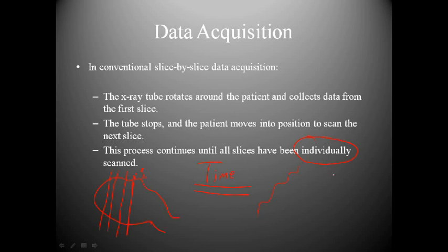And so it has a stair-step pattern, and it looks like you're missing information here and here and here. Okay, and I'm sure that you've seen it before. And so I take the patient back over, and typically we didn't do coronals or sagittals. We just did axials and bone windows on axials, and that was it.